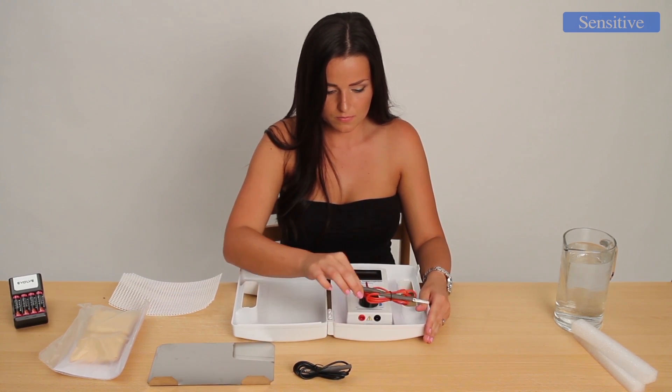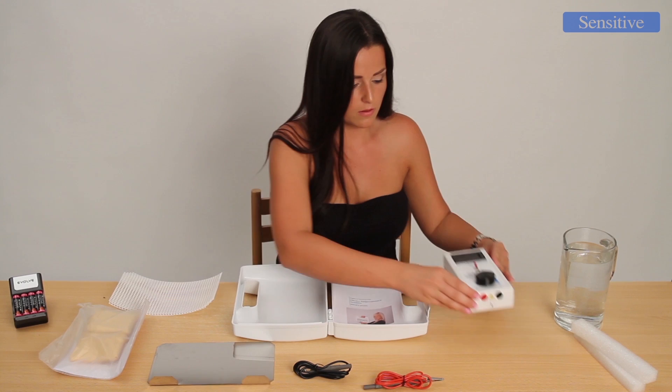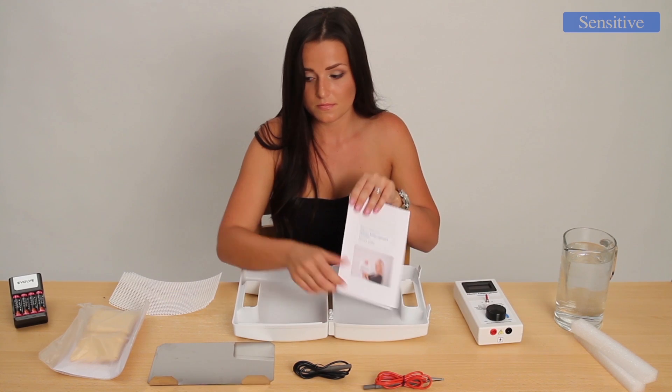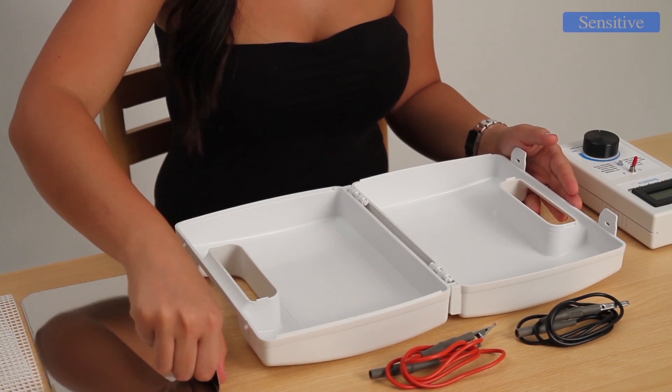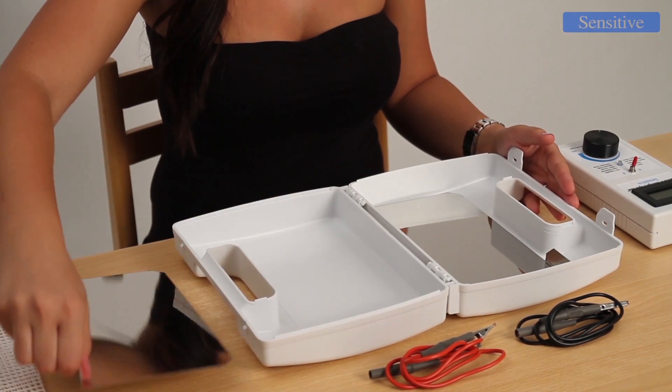Contraindications of the Electroantiperspirant Sensitive device are metal orthopedic implants in the place of therapy, pacemaker, and pregnancy. There is a detailed instruction manual available in all languages, including English. Getting the device to work is really simple and can be done by anyone who has read the instruction manual.